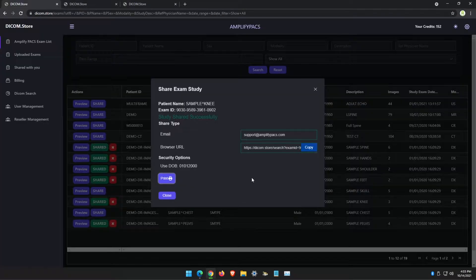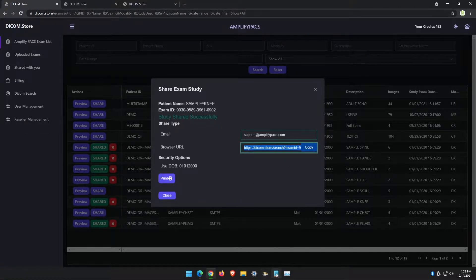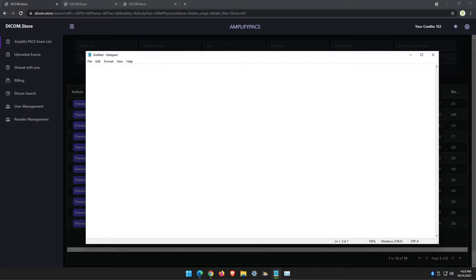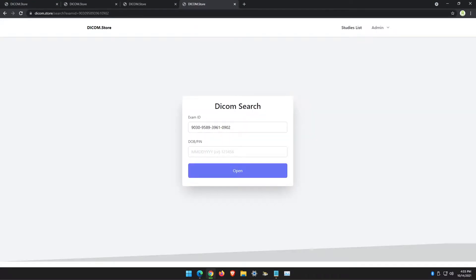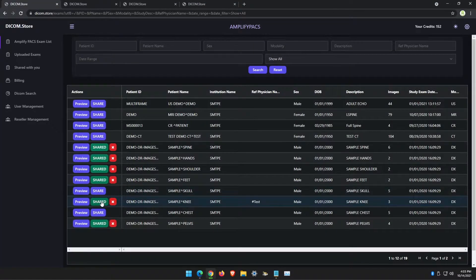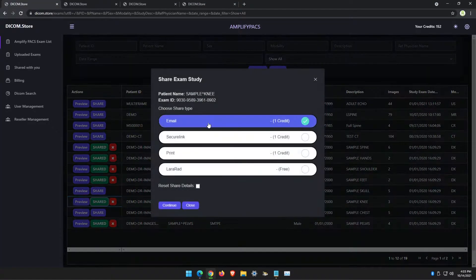If you wanted to use the link option, you can just copy the link, and then you would be able to attach that to an email and send it manually. When the user clicks on the link, they're still going to need to enter the date of birth. After you've shared an exam, you can always re-share it and email it to another person.